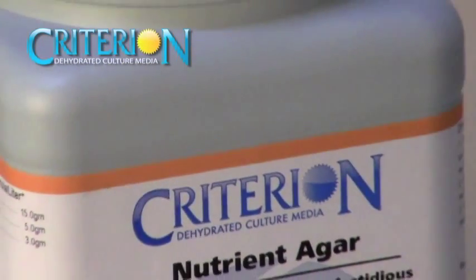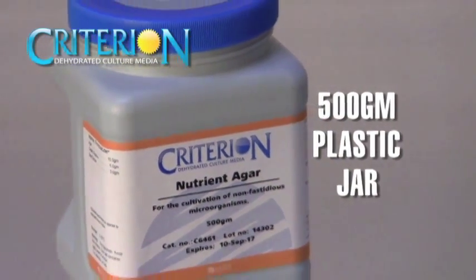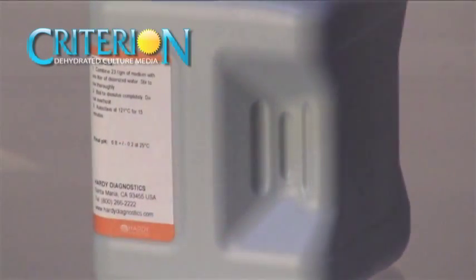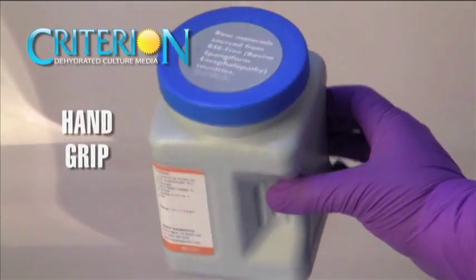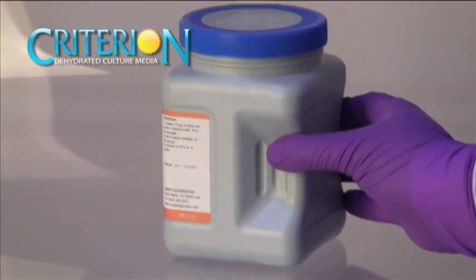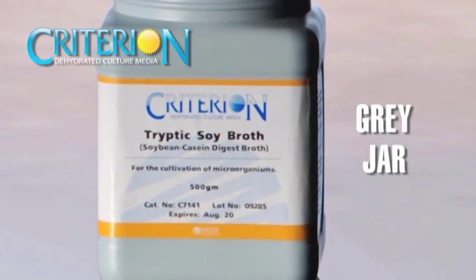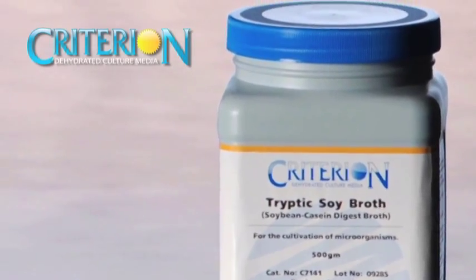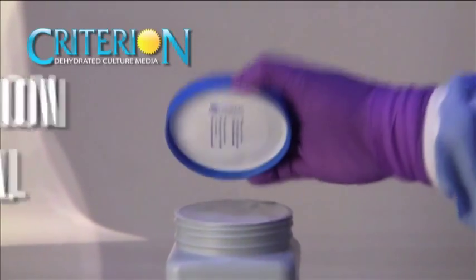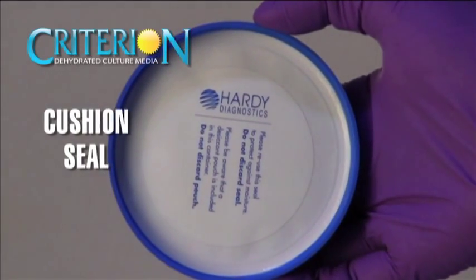The most commonly used format of Criterion is the 500 gram plastic jar. A convenient hand grip design features finger indentations to allow for easy and safe handling of the container. An opaque gray jar diminishes light penetration, prolonging superior performance and shelf life. A built-in cushion seal inside the lid prevents moisture from entering the previously opened container.